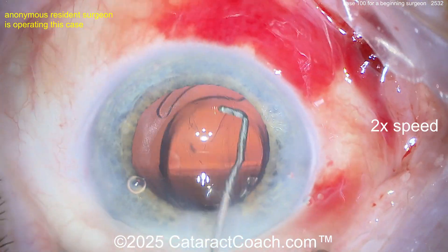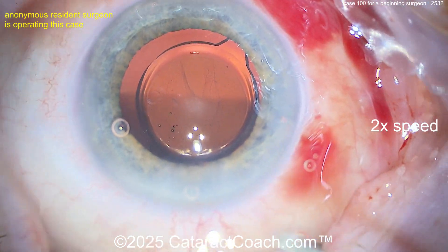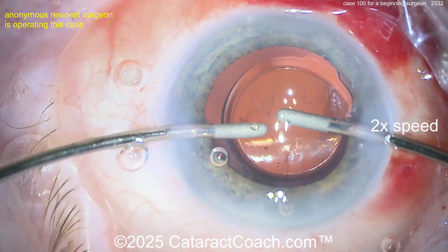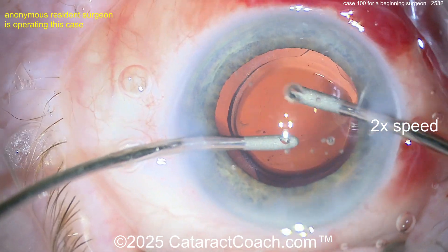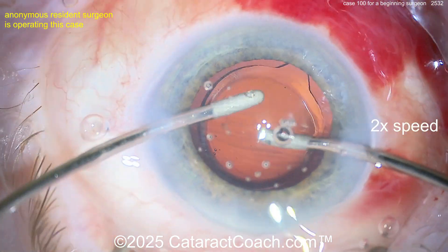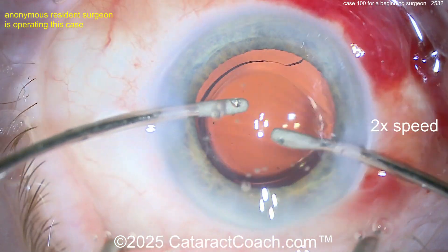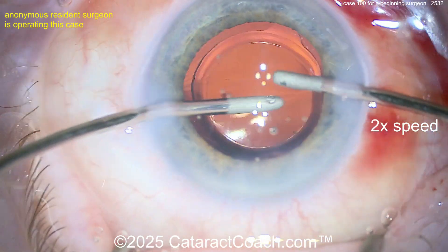Here comes the lens going into the capsular bag — nicely done. Get it rotated around. Looks like a monofocal acrylic single-piece lens, a Tecnis ZCB00 or similar type lens. Now cortex and viscoelastic removal using the bimanual approach. You probably want to tilt at least a little bit behind that optic — remember, you're going to get toric lenses one day. You'll need to remove the viscoelastic from behind the optic, so the optic should sit directly on the posterior capsule.